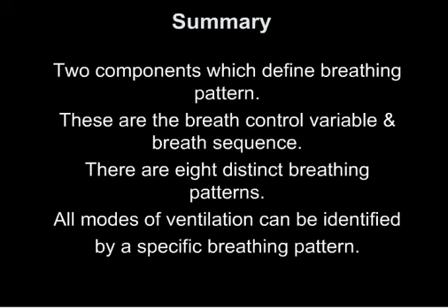In summation, there are two components which define breathing pattern. These are the breath control variable and breath sequence. There are 8 distinct breathing patterns. All modes of ventilation can be identified by a specific breathing pattern.